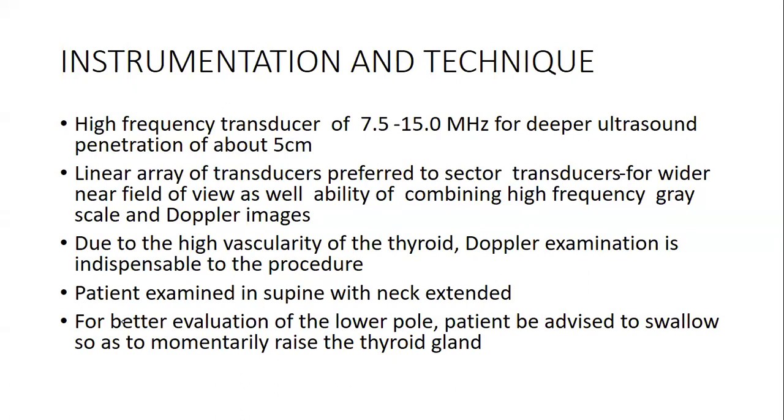Due to the high vascularity of the thyroid, Doppler examination is indispensable to the procedure. It's a sin to do a thyroid ultrasound without Doppler interrogation. This is because of what I tried to talk about, the high vascularity of the thyroid gland.